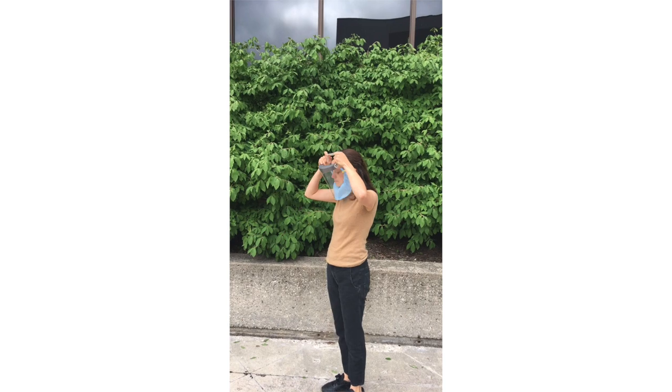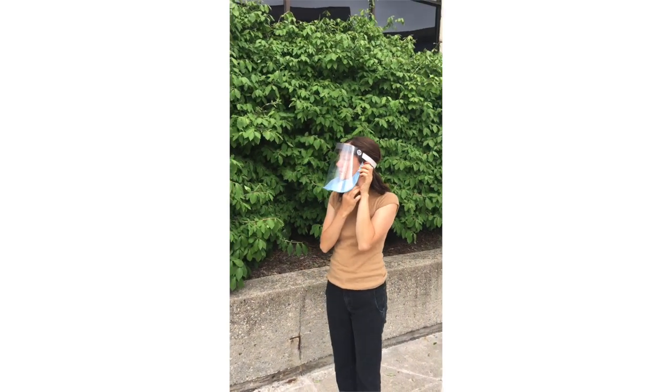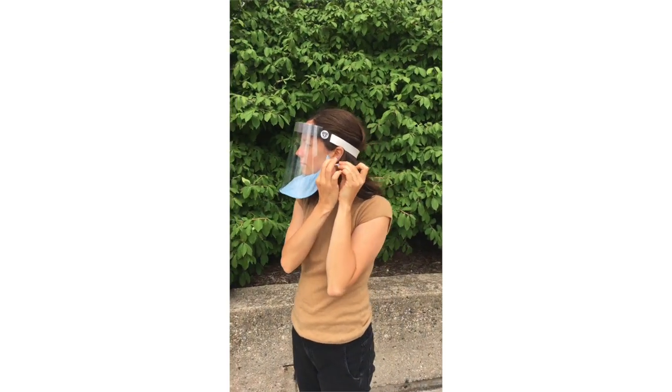Welcome to Badger Shield Plus. Badger Shield Plus was developed with the University of Wisconsin-Madison College of Engineering, Midwest Prototyping, and UW Health.